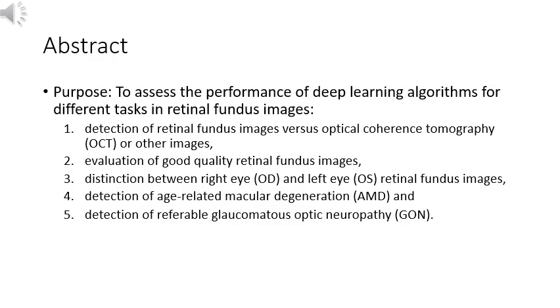Purpose: to assess the performance of deep learning algorithms for different tasks in retinal fundus images. 1. Detection of retinal fundus images versus optical coherence tomography, OCT, or other images. 2. Evaluation of good quality retinal fundus images.